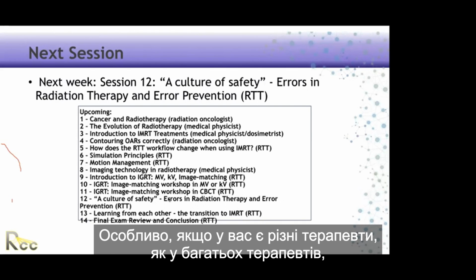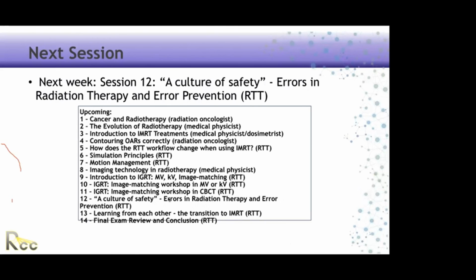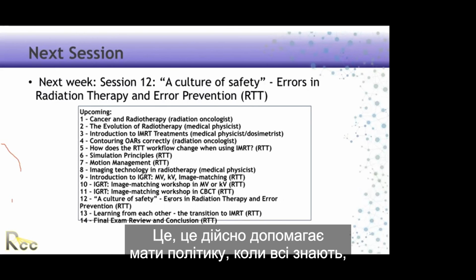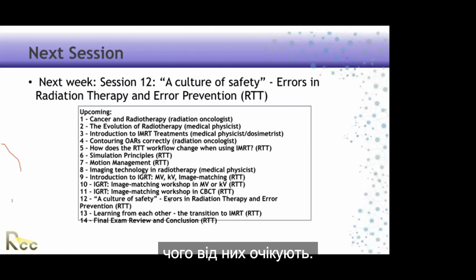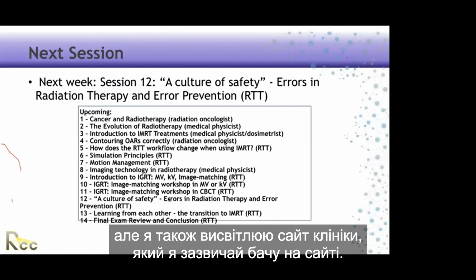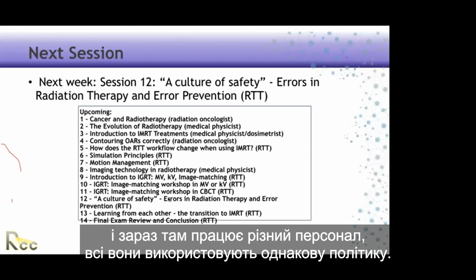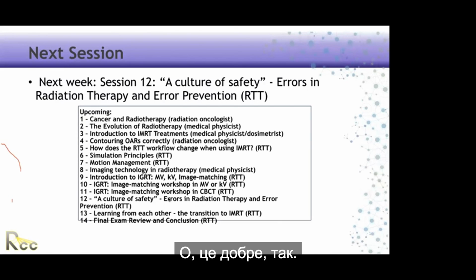Especially if you have a lot of therapists in a big department, it really helps to have a policy and everybody know what the expectation is. Agree. As you mentioned, I cover a site within Elekta, but I also usually cover Halcyon and Clinac sites. So even though they're different machines, and different staff are involved, they all use the same policy. Oh, that's good.